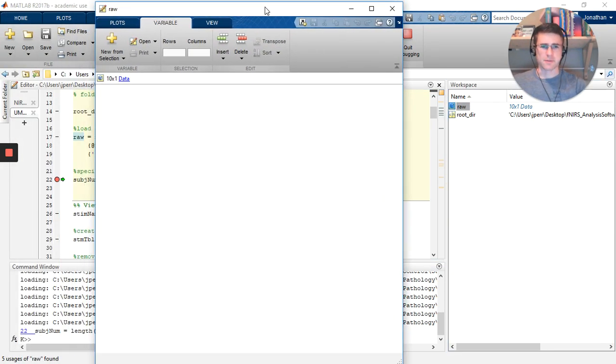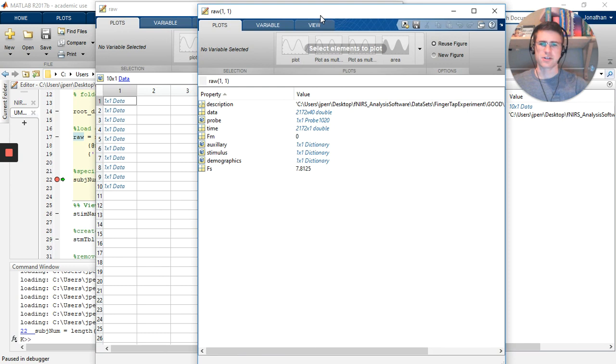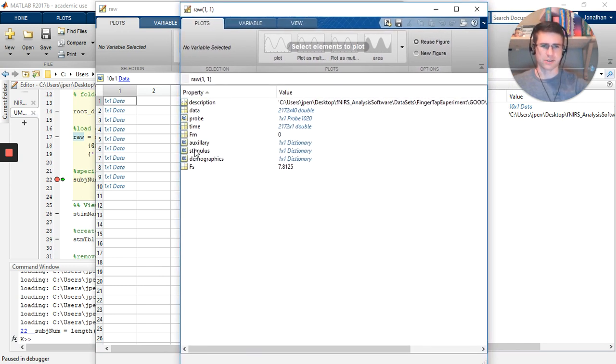In most experiments, you're going to have some sort of task happening, especially if it's a block paradigm, for some set duration. When you load in data, you can find this duration with a default value. In your raw data, you select one of your subjects. I have subjects 1 through 10. Each subject will have a stimulus subvariable.